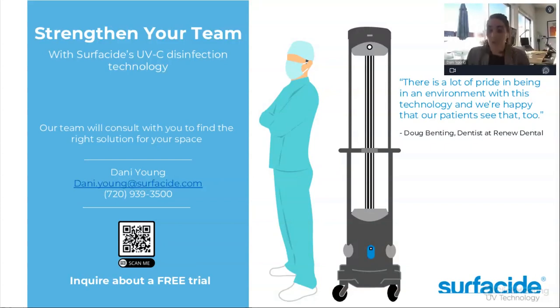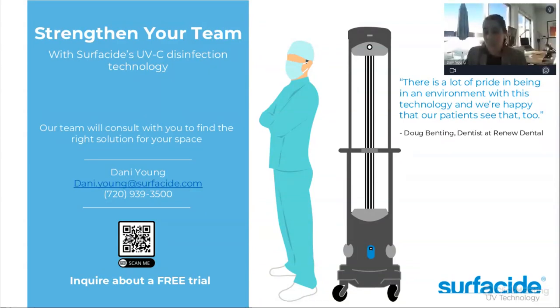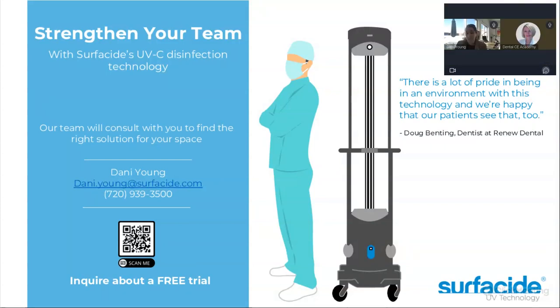I do want to let you know that UVC light is different than ozone. Ozone is actually a chemical. UVC light is not a chemical. There are no chemicals being used in here. So after you turn off the lights, it is safe for you to walk in, and you're not being exposed to any ozone.